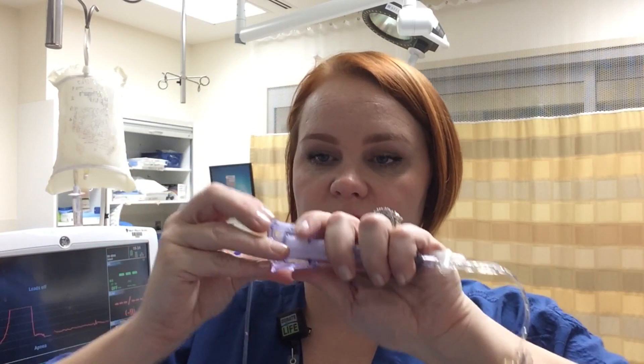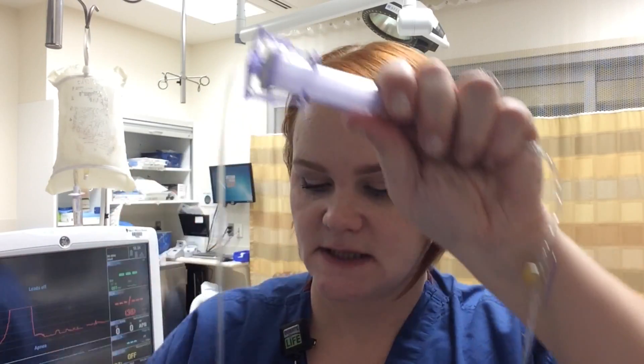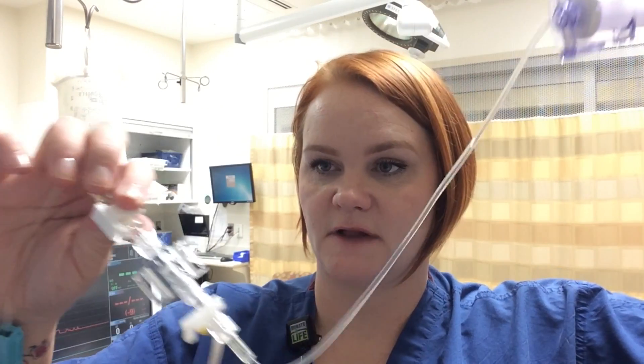Push everything back in, give the patient back their blood, clamp it in place, and flush until there are no bubbles or blood remaining in the line — then you should have a nice waveform again. You should zero an A-line before insertion, after each lab draw, and every four hours while the patient has it in place.